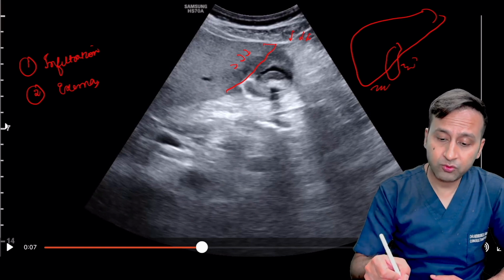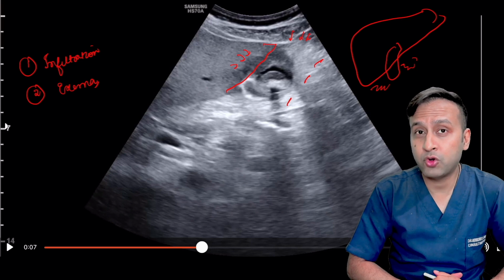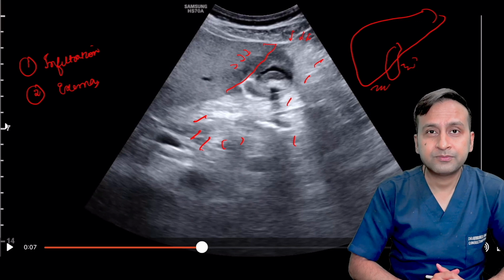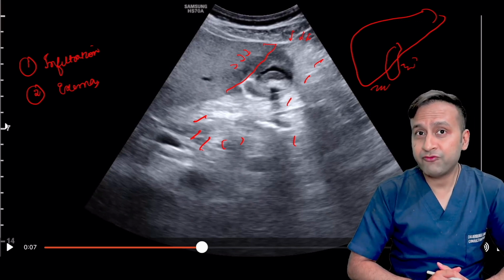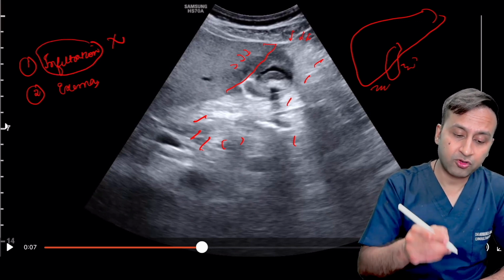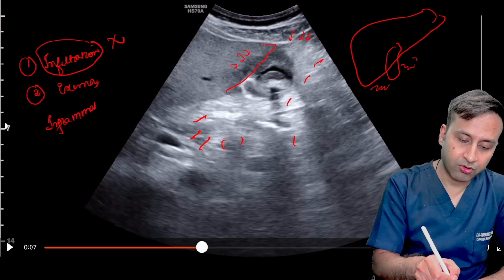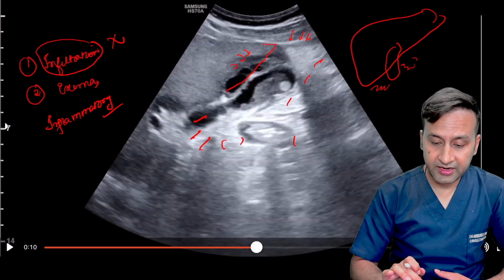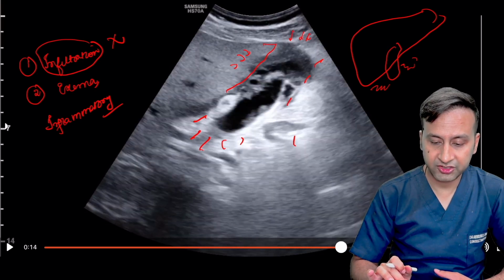Now, if you see the echogenicity plus the nature of this fat, it appears to be somewhat abnormal. It appears to be abnormally echogenic compared to the fat here, and here, as well as here. Now, this abnormal echogenicity of the subhepatic omental fat is because of inflammation. It means that probably we are not dealing with a malignant pathology, but we're dealing with some form of an inflammatory pathology. Then, when I'm just completely ending the video, I don't see any area of a pericholecystic collection.